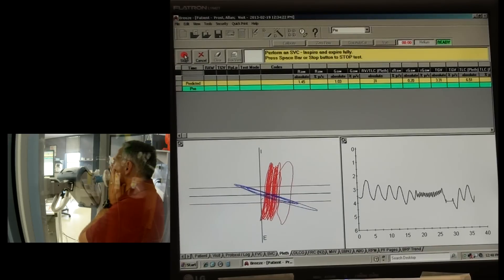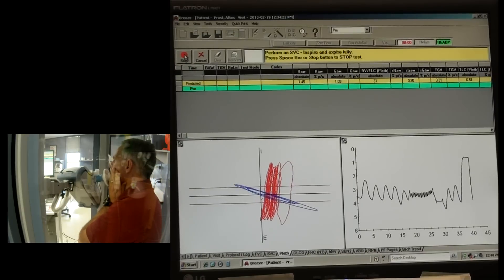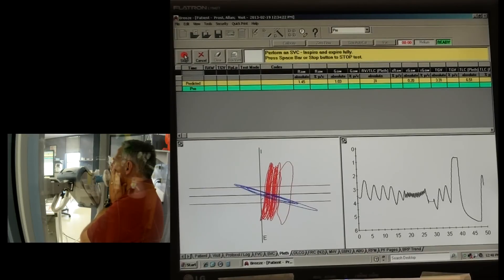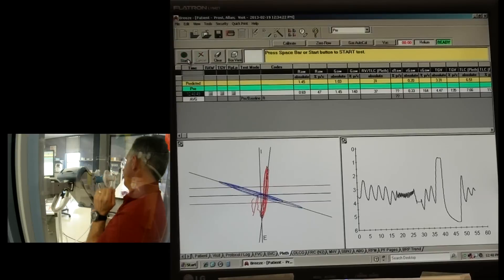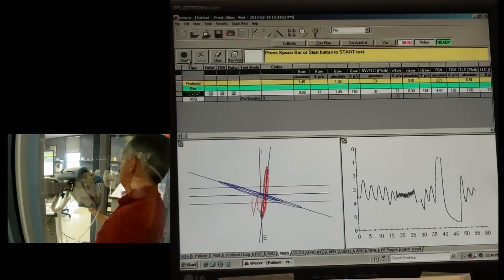Nice, easy breathing. We're going to do a slow vital capacity - all the way in. Big breath in, big, big, big as you can. Now blow it out. Keep blowing, keep blowing, as long as you can. Keep going, keep going, keep going all the way out. Keep going all the way out. And relaxed. Nice, easy breathing now. That didn't seem too hard. There's the plethysmography test.